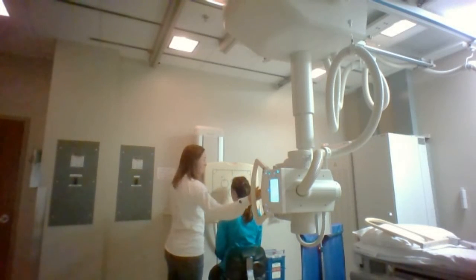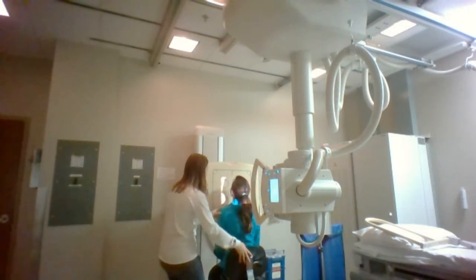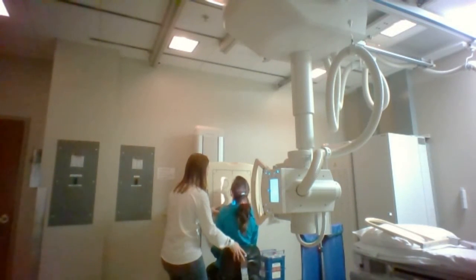Okay, so now Sky, just so I can get you in a better position, tilt your head back for me, up there, and I'm going to have you scoot up until your chin's touching it.